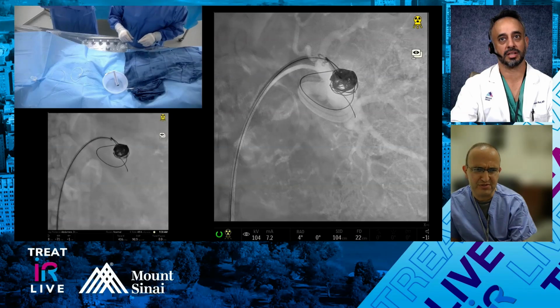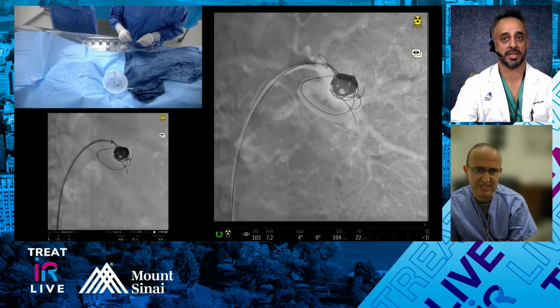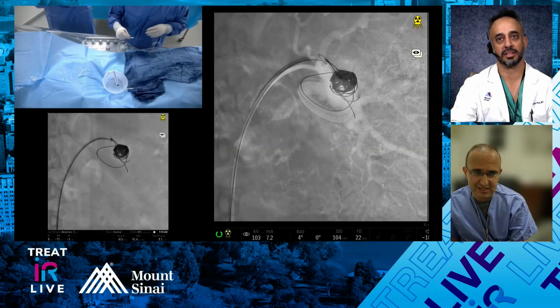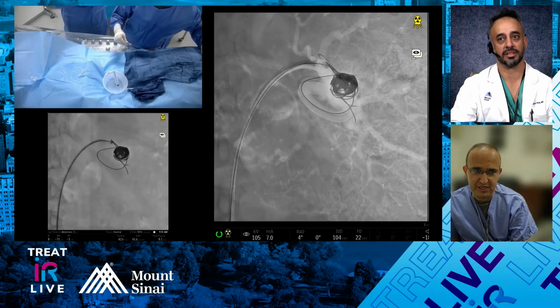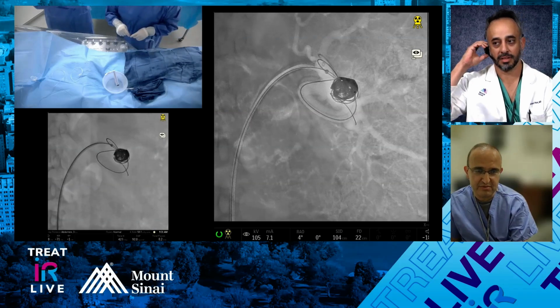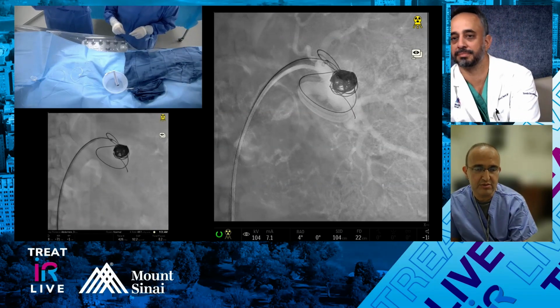Do you guys have longer pushables? So I leave those, the nesters, right? The micro nesters are 14. So this is basically three times the length of a micro nester. I know it's still more expensive than a pushable, but it definitely evens it out a little bit.